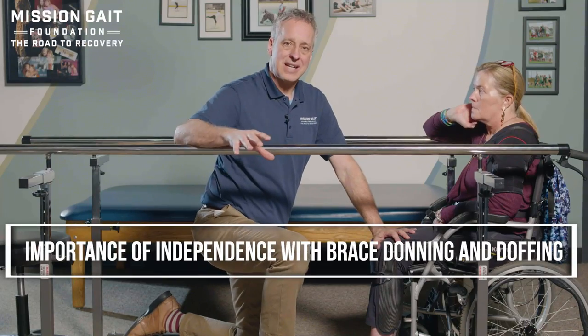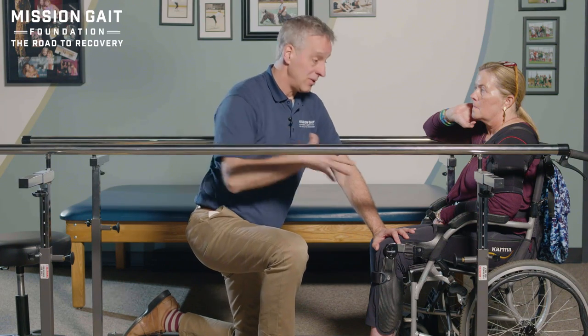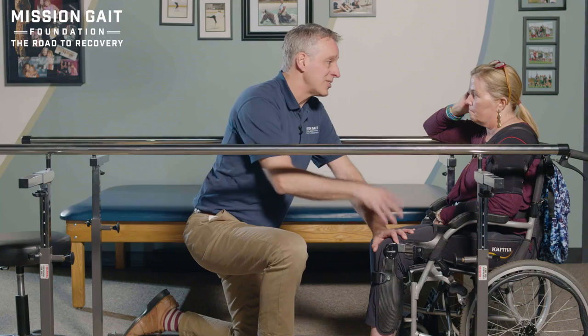Once we have the patient sit back down and we've got the brace, shoe, and everything in place, the key isn't so much that we can do that for her here — it's what can she do at home? Sometimes, with a patient working with one arm for function, can they do it themselves independently? Maybe not at first. So you want to bring in a family member or aide, someone she can work with on a regular basis, and make sure you train them as well. Over time, she builds up more independence in being able to manage all the different moving parts of the K-AFO.